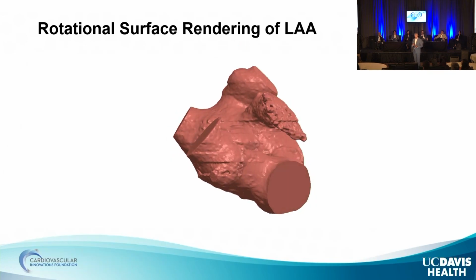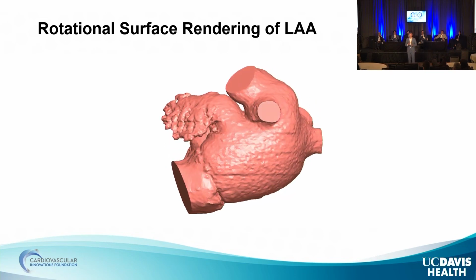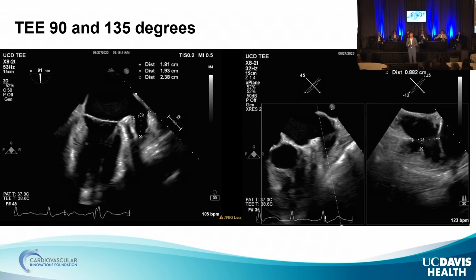So 25 by 21, this is a rotational image of the appendage. You can see there's a lot of distal anatomy, which is not really relevant. These are the static images that we're more accustomed to on the table, 0 and 45 degrees, and then again 90 and 135. And like some of the other cases we've seen, there is a prominent pectinate on the 135, and that's really the problem with CT, as Rahul mentioned, that you just often don't see these pectinates, and Nadira as well. I think it's a limitation of CT, and we've tried different gain settings and everything, but we're often surprised that there are some more prominent pectinates. But in any case, the depth here to the pectinate, which is where we put the ball, is about 9 millimeters, and the ball's only 8 millimeters tall, so there's still plenty of depth here.